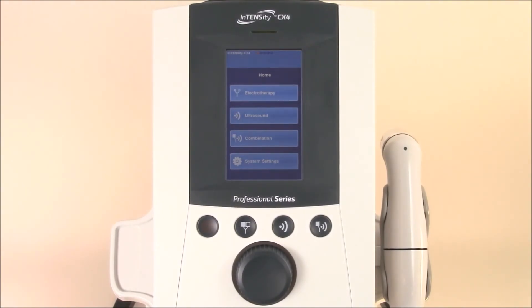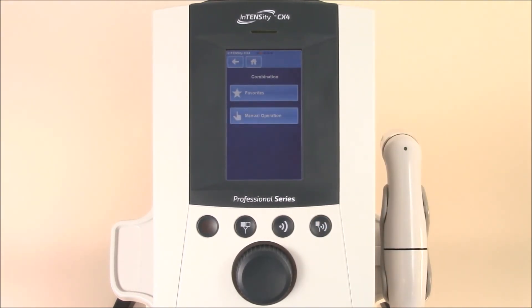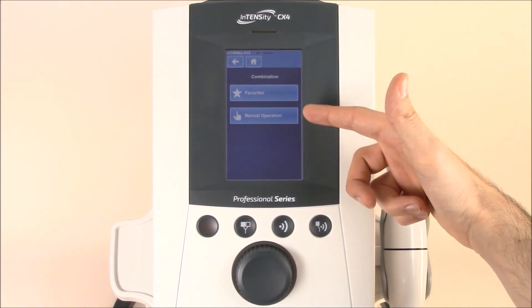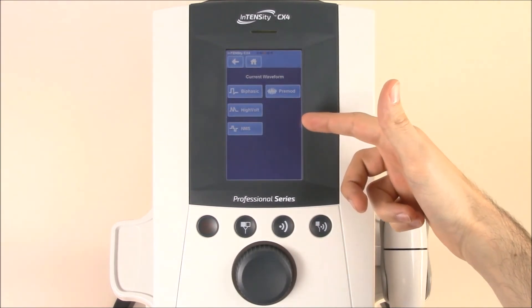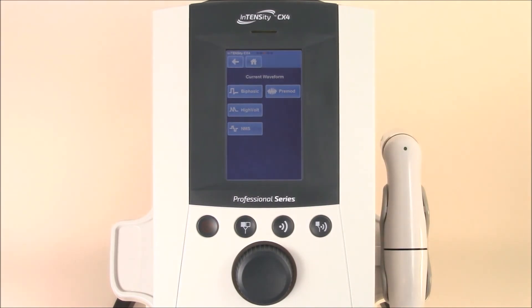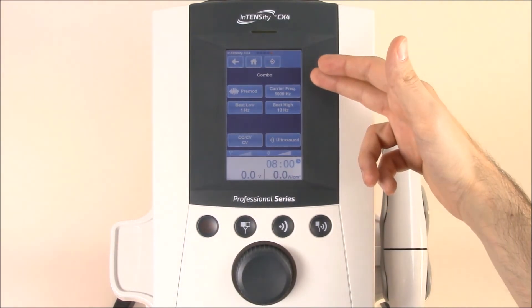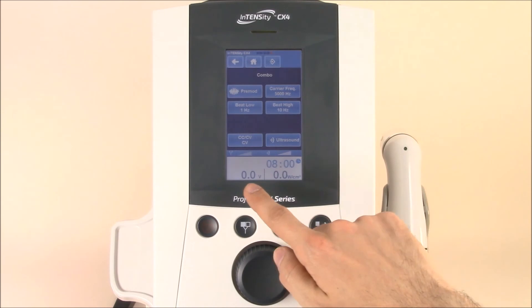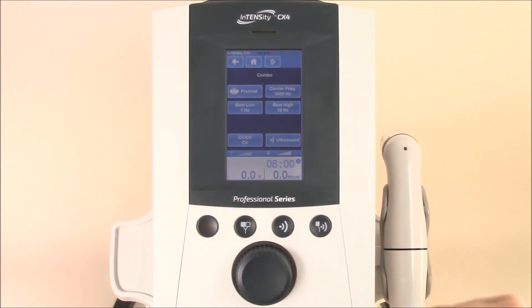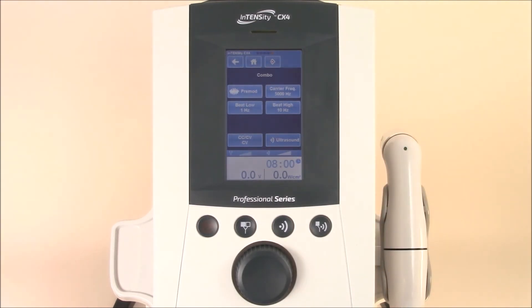Now that you're familiar with electrotherapy and ultrasound, let's jump into the combination screen. Once on the combination screen, you'll notice that you only have manual operation and favorites options. Simply open up the manual operation and you'll see that your first option is to select a current waveform in the electrotherapy portion. Let's use pre-mod for demonstration purposes. On the first screen, you'll see all of your electrotherapy options and parameter settings. You can still adjust the timer and control both power options for ultrasound and electrotherapy. If you need to change your ultrasound settings, simply hit ultrasound and adjust the settings there. Once you're ready to get started, you can control both power settings, turn on the machine, and get going. To jump back to the home screen, simply hit the home icon up top and you're back to the beginning.